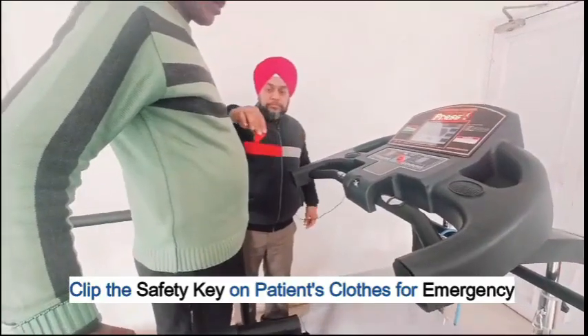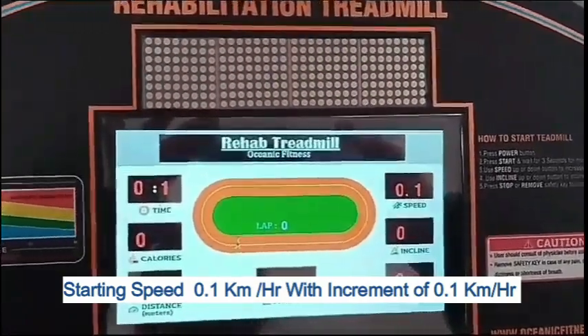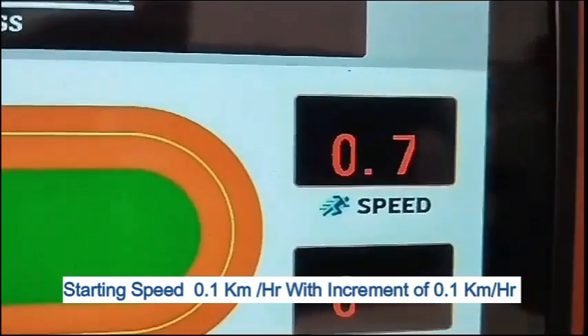Clip the safety key onto the patient's clothes for emergency use. Starting speed is 0.1 km per hour with increments of 0.1 km per hour.